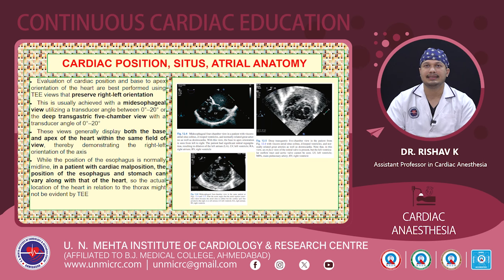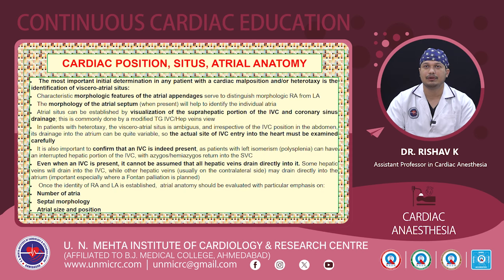As we can see in the slides on the right of the screen, this is the mid-esophageal 4-chamber view in a patient with visceroatrial situs solitus, D-loop ventricles, and normally related great arteries. It can be appreciated using the different TEE views. Similarly, as I have shown in the pictures on the right, the deep transgastric view can also be used for this situation. Now coming to the visceroatrial situs, that is how to determine it.